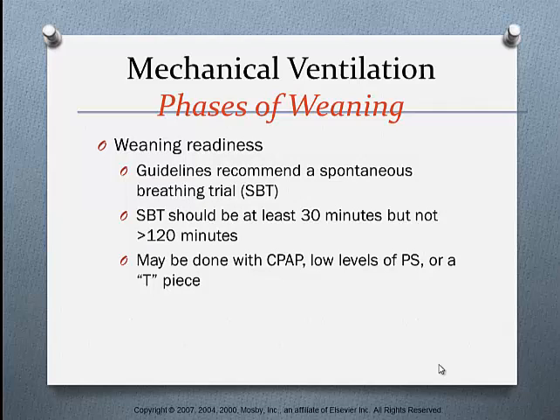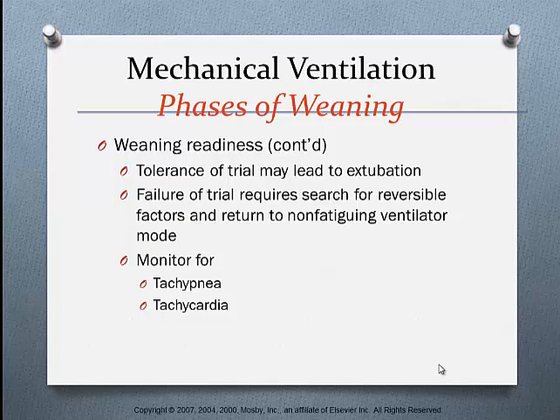Weaning readiness. There are guidelines that recommend a spontaneous breathing trial. A spontaneous breathing trial should be at least 30 minutes, but not more than 120. We can do this by putting them on CPAP, low levels of pressure support, or a T-piece. If the patient is tolerant of the trial, they may be extubated. Failure of the trial requires a search for reversible factors and returning the patient to the ventilator mode.